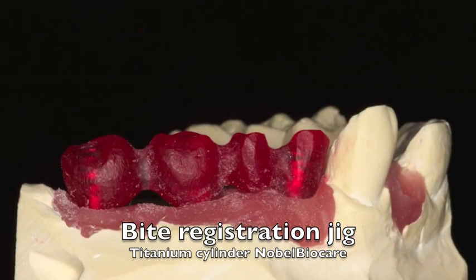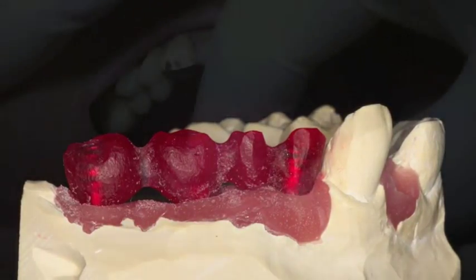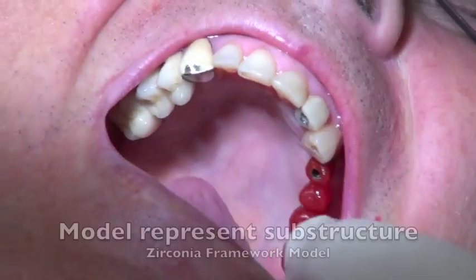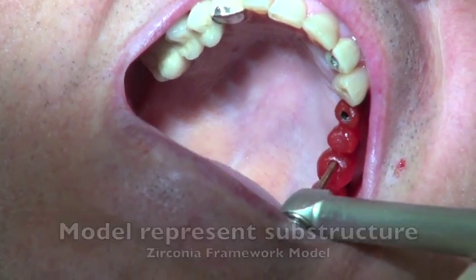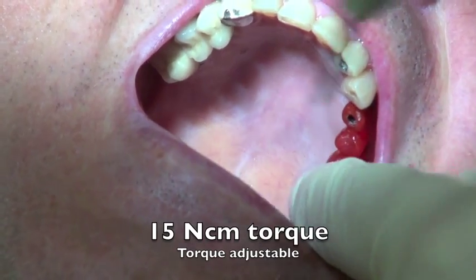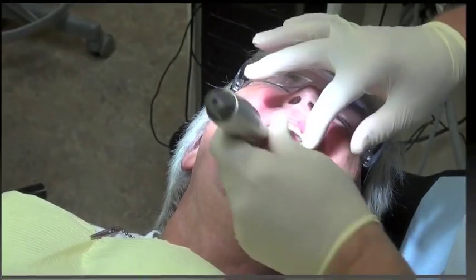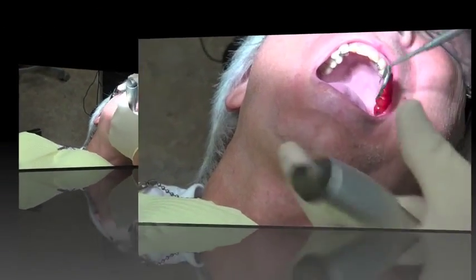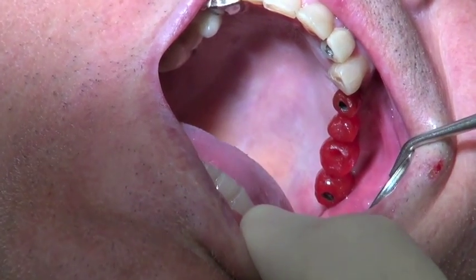We have the model and we're going to use the bite registration jig to get this model mounted in the centric bite. We put this on the patient, starting with the first screw, then tighten down the rest of the screws. One of our goals is also to verify our model. We'll tighten this down to about 15 Newtons, then have a look and just make sure that it's passive fitting.